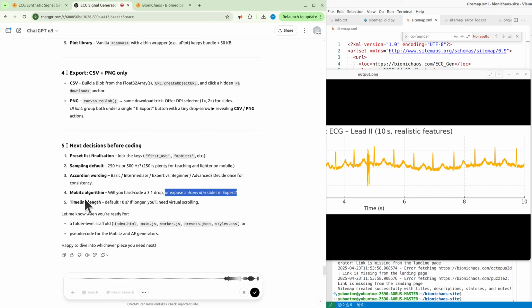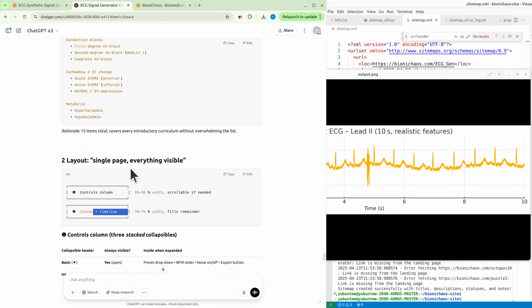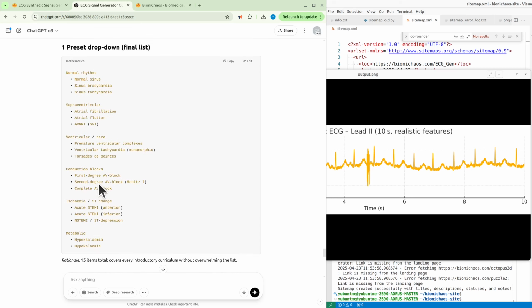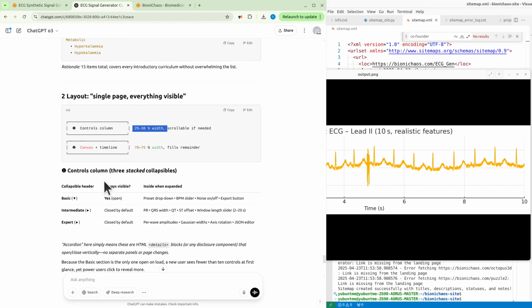Yeah, not sure about the Mobitz algorithm. Maybe you can make a suggestion on that one. Yeah, and 10 seconds should be plenty, but not sure if we need an option to change the window size. Okay, I like it. Okay, so we have the final list of preset drop-down: AF, atrial flutter, atrial fibrillation, tachycardia, AV blocks. Okay, so we have the basic layout, about 25-30% controls and 70-75% canvas plus timeline.